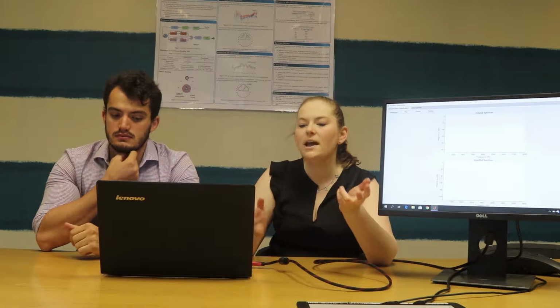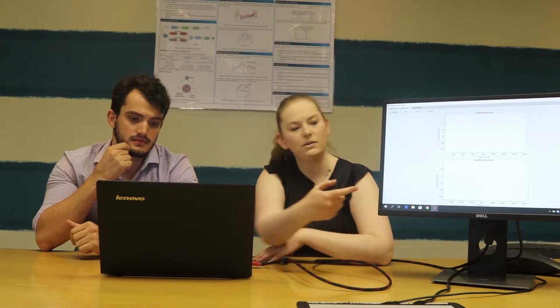With our project, we started out trying to develop a fully functioning hearing aid, and then we hit some technical roadblocks along the way. So what we decided to do instead was a full software simulation and then just a small hardware proof of concept. We used the MATLAB GUI designer and many of MATLAB's toolboxes to perform our software simulation. That's the GUI that you can see on the screen over there. It's a full working hearing aid, except that it doesn't use real-time audio, it uses a pre-recorded audio signal.